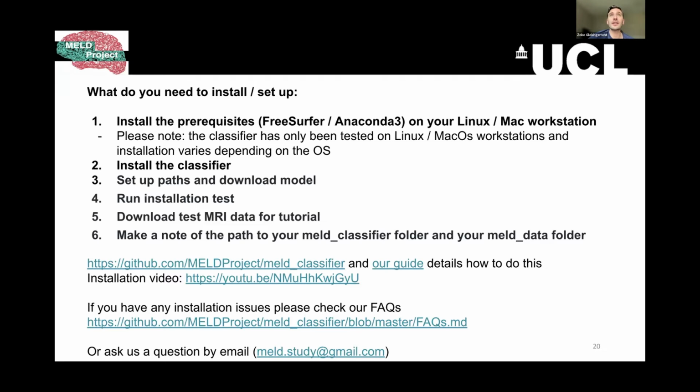Do you guys know if you can get an older version of FastSurfer than your FreeSurfer? Can you have both? If I have the very latest version of FreeSurfer, can I get an older version of FastSurfer? I don't know if Konrad or Mathilde have an answer for this, but you can have different versions of FreeSurfer installed. You don't have to delete. You can have 20 if you want; there will just be different folders saying 7.4 and 7.3 and 7.6 and whatever. A lot of people do that, and they have downloaded version 6 if they want to run some scans they had 20 years ago or whatever.